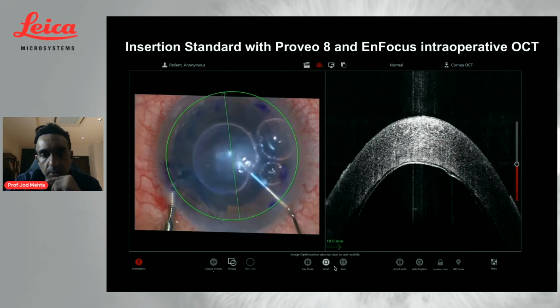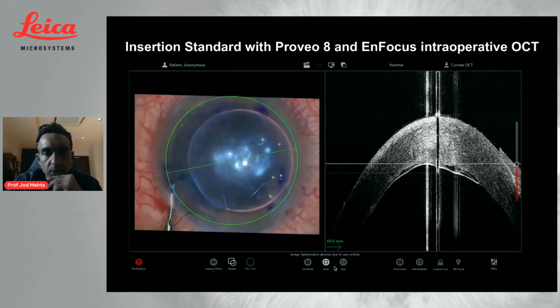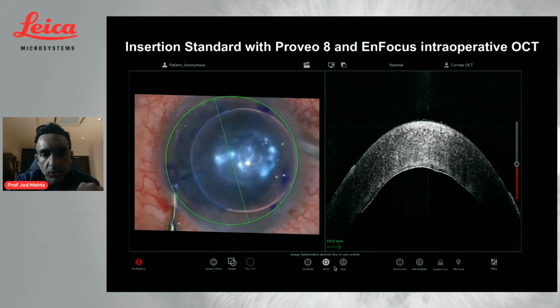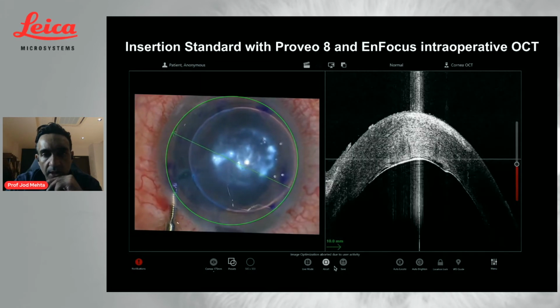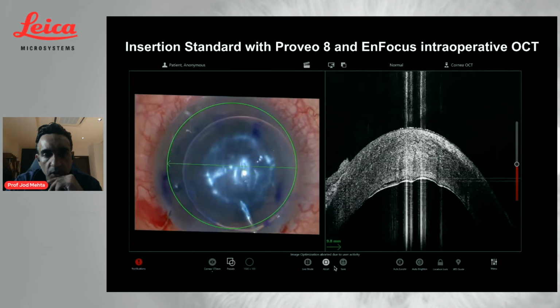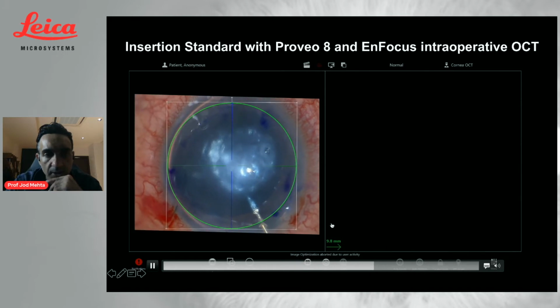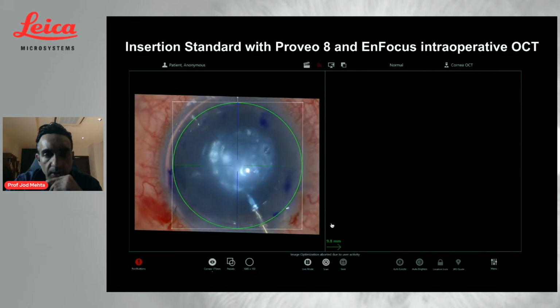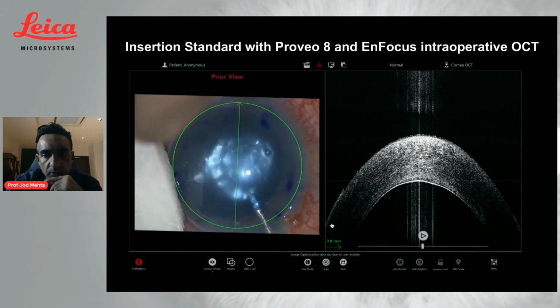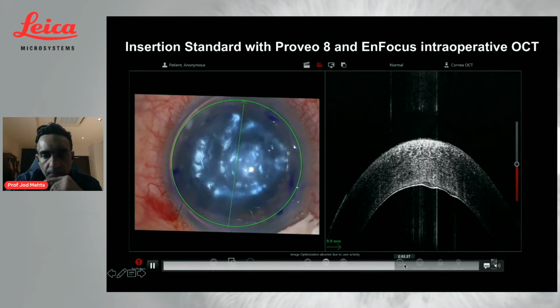So it requires less manipulation as well of chasing the graft around the eye, because you can put it directly in the position that you want. Once you get a better tamponade, I like the radial scan, like you can see on this one, so it goes all the way around, so you can see all the graft positioned. And then once you're happy with the position of the graft, I put a full air tamponade. I like using SF6 gas. I normally use 20% SF6 gas for all my tamponade cases. And then you get a full fill, and you can check that the graft is nicely adhered all the way around the cornea.